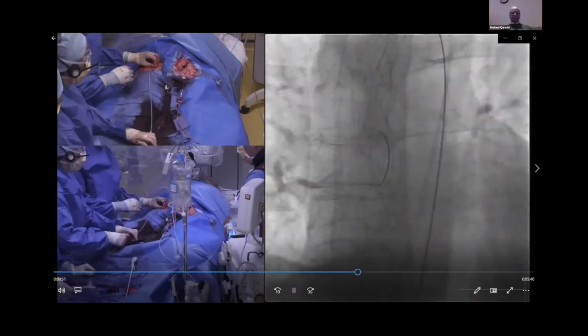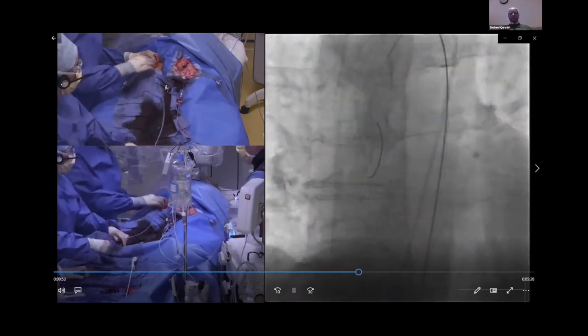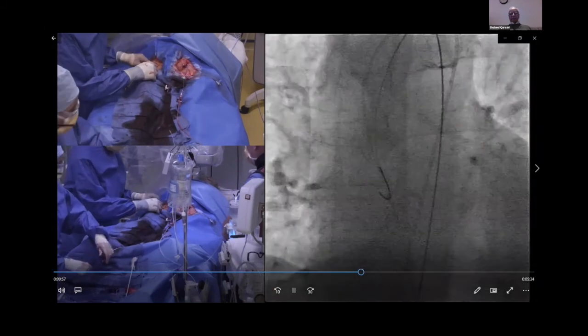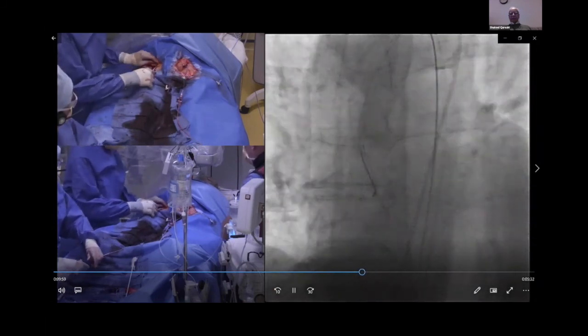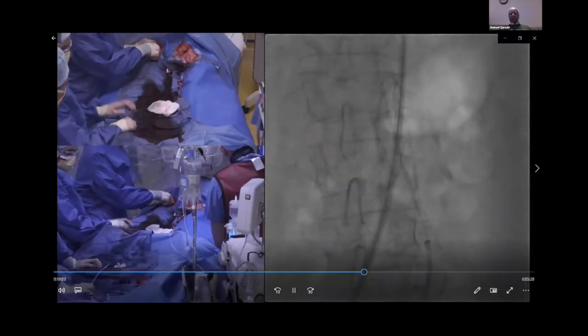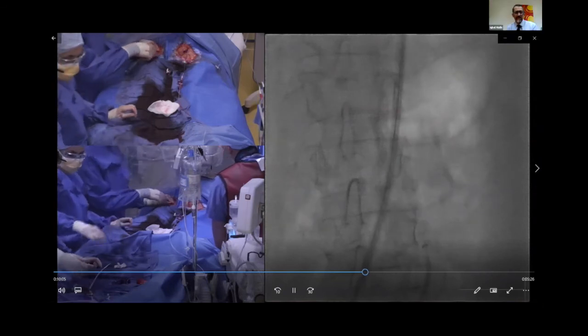Also, Iqbal, whilst it's playing, if in the region where you want to burn, you find that there is a lot more calcium extending higher up, then is it essential that you do it at that point, or can you go higher? So the planning is key.